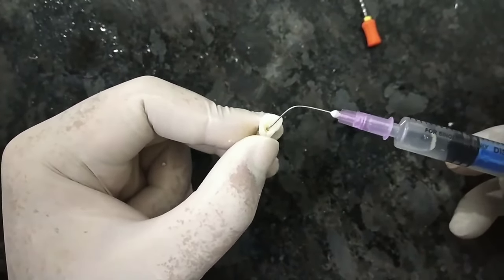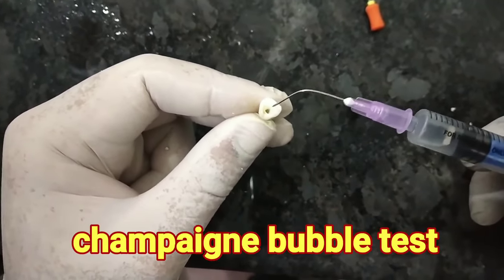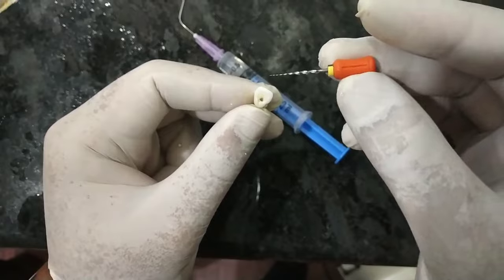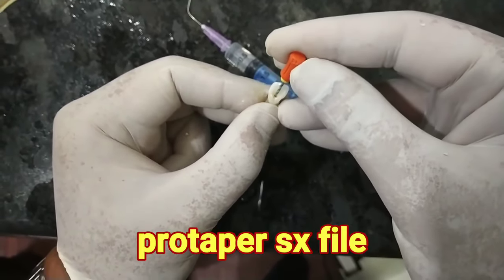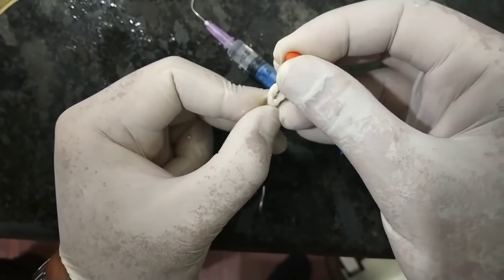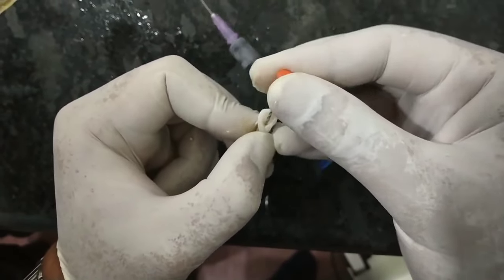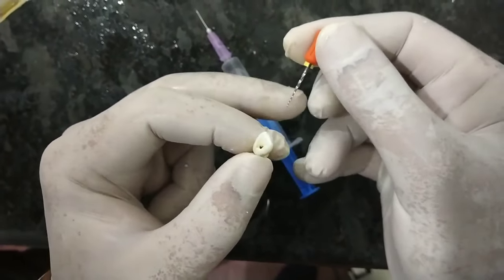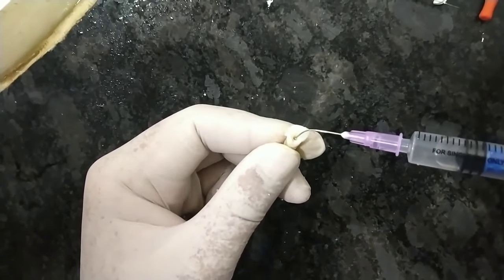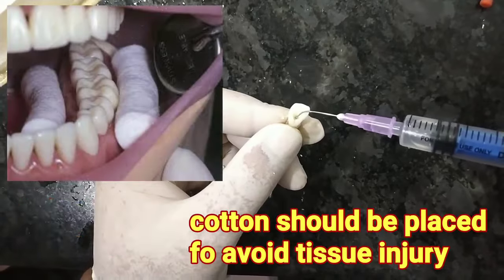Many people ask how you know the canal is there or not — we do a champagne bubble test. Just 2 to 3 drops of 5% sodium hypochlorite inside the opening and you can see bubbles coming out. When you see bubbles, that means you have found the canals. Now using the SX ProTaper file to enlarge the opening of the canal — just insert it inside the tooth, rotate it 3 to 4 quarter turns, then reverse rotation, and pull. Do not use the SX file in more than 5 to 6 cases otherwise it may break. After using the SX file, irrigate with saline and sodium hypochlorite solution in equal concentrations.